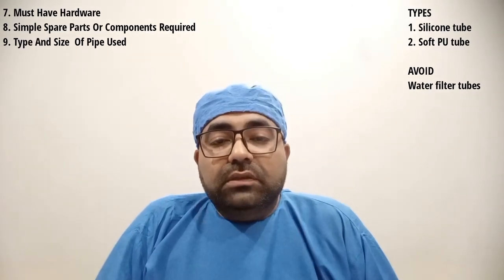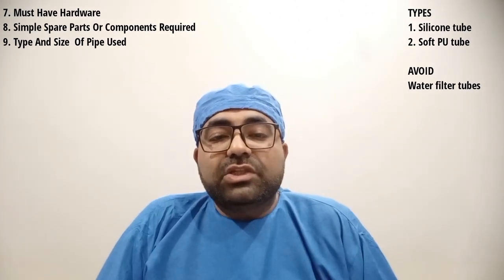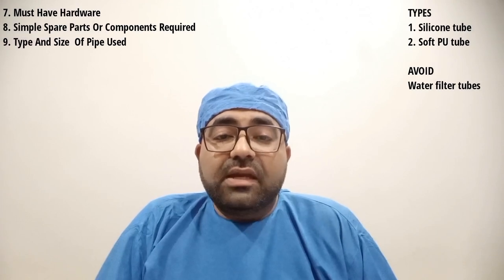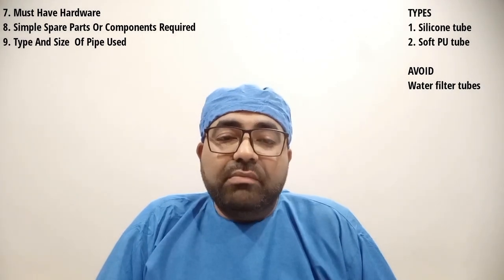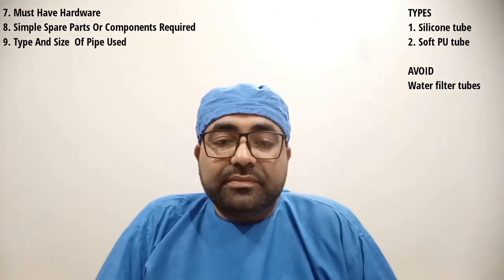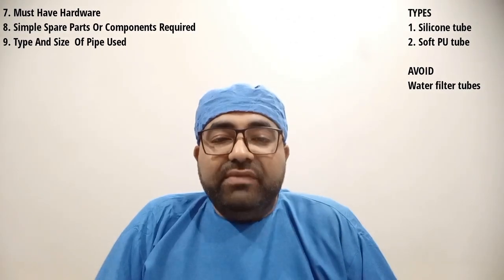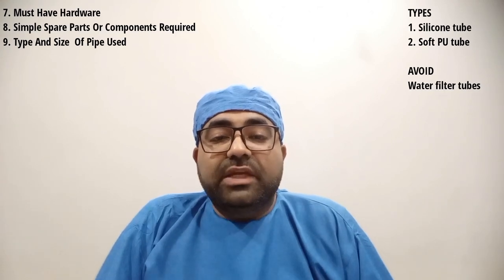For any doctor getting a new dental chair in future, I would suggest strongly insisting to your manufacturer or technician that whenever they assemble your dental chair, they should give utmost importance to using good quality food grade silicone tubing, or at least top quality extra soft PU tubings. By doing so, it will help you avoid any air or water leakages for a minimum of three to five years. The next topic is regarding the size of tubings used in dental chairs.